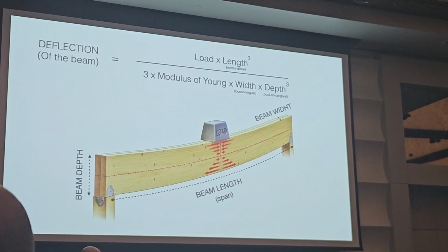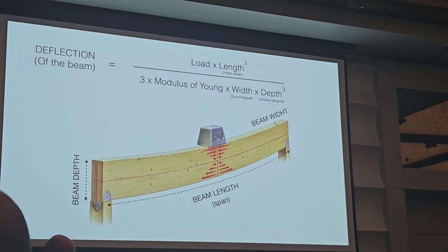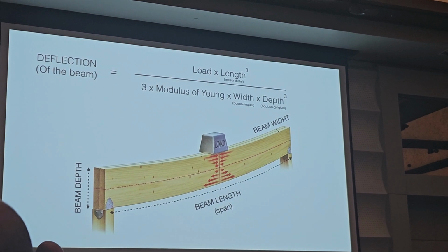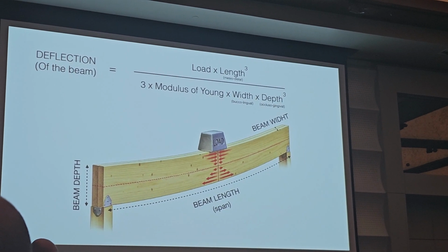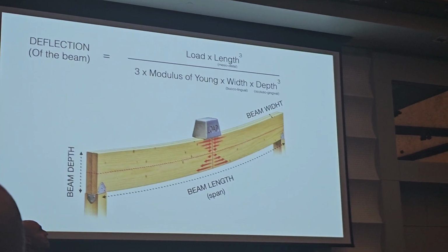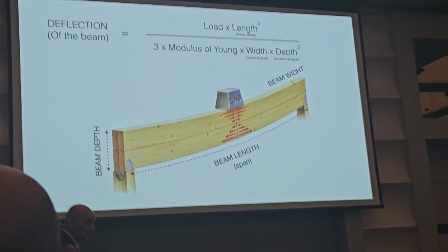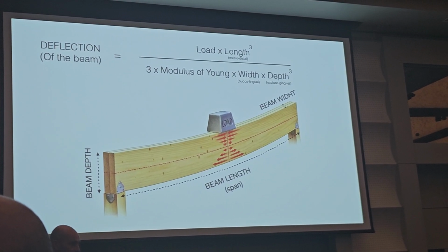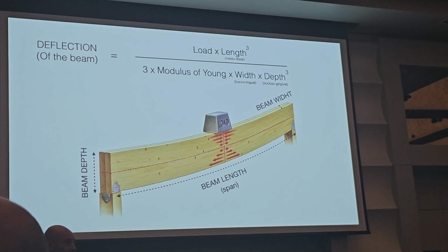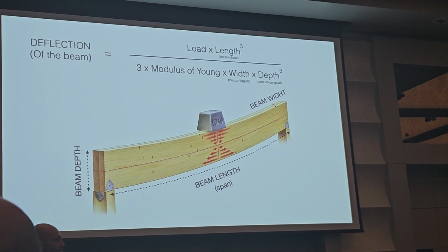That's why if you have a long span bridge in zirconia, and you have less than 4 millimeters in height, usually your technician enlarges the connector horizontally. Look, I have 12 square millimeters, 2 here and 6 here. It's useless. You cannot cope. You can cope just with the verticality of the connector. That's why your technician should send you 12 square millimeters with the main axis vertical, not horizontal. That's why zirconia bridges crack. If you have a zirconia bridge with a height of more than 5 millimeters, it's unbreakable.